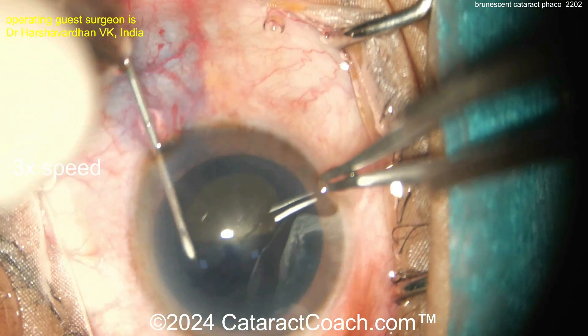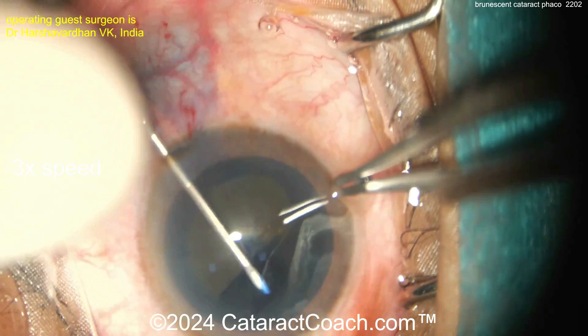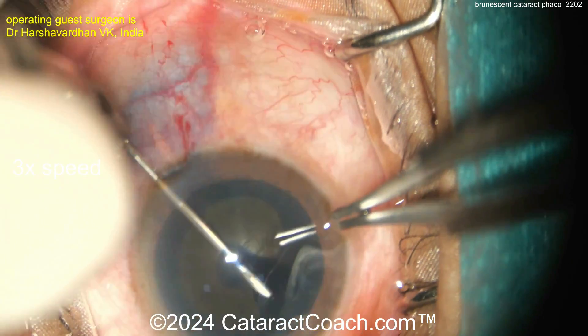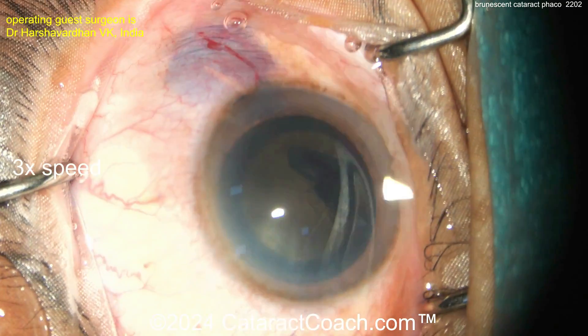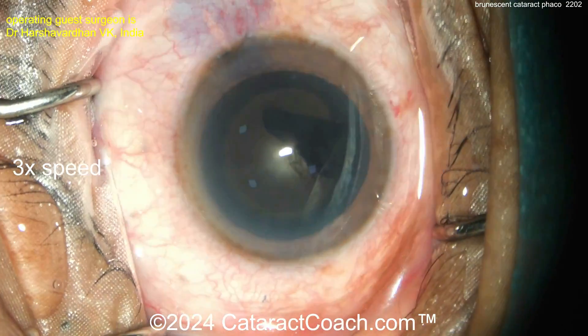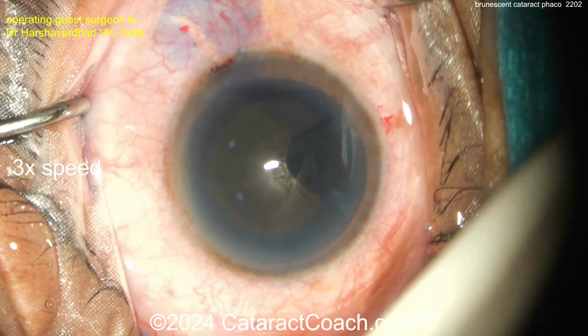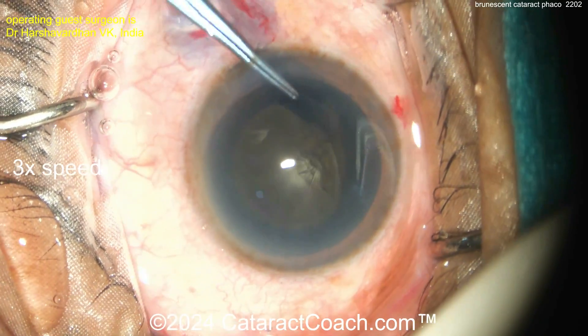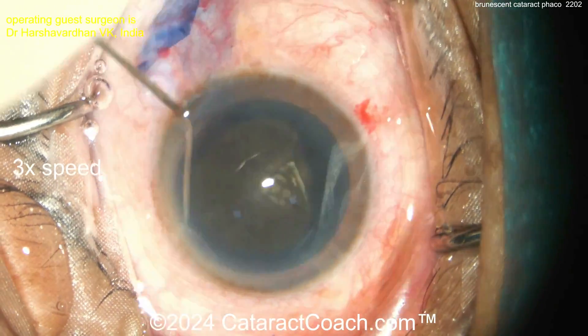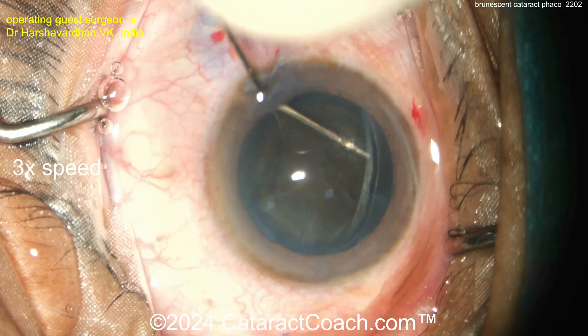Rotate that around and get a generous rhexis. Do not make a baby rhexis with a brunescent cataract. This surgeon is doing a beautiful job — nice big generous rhexis. Five and a half millimeters is my goal; even six and a half is fine. But don't make a baby rhexis. If it doesn't overlap the optic, that's okay — let's get this cataract out.